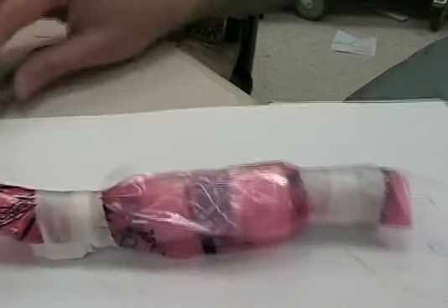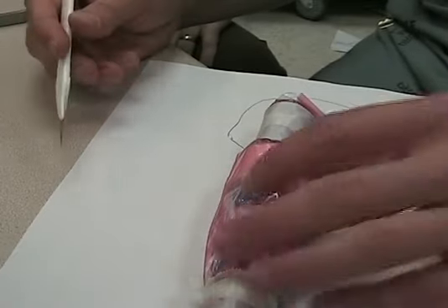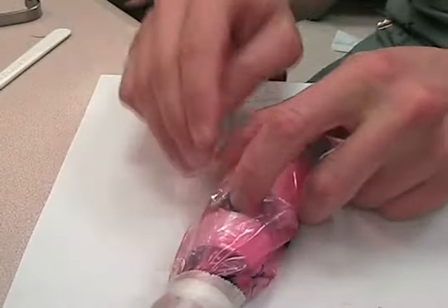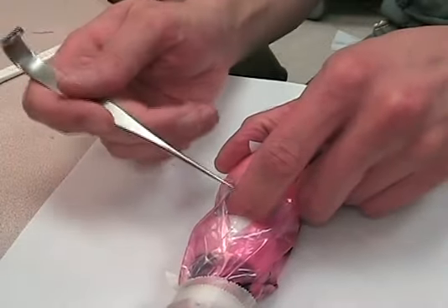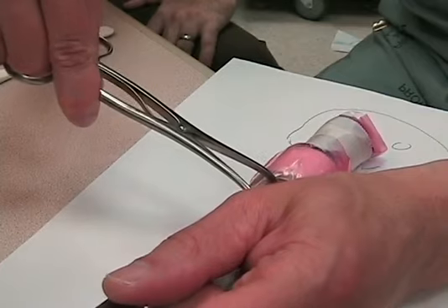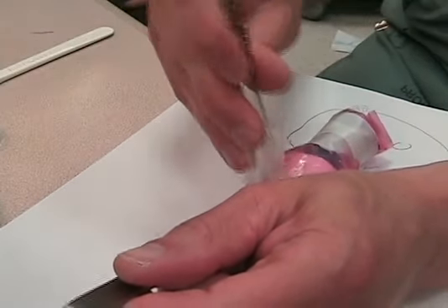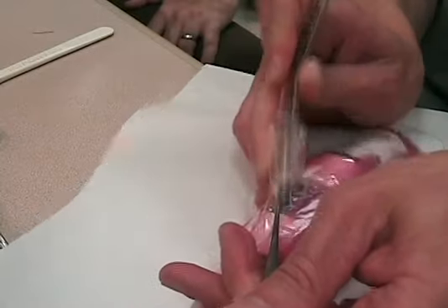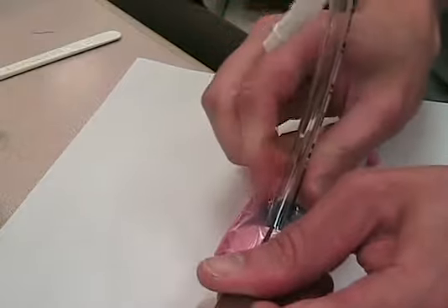Let's say you're alone — you don't have a partner. In this case, you're actually going to stand close to the head of the patient's bed. The same initial steps: find the membrane with your finger, stabilize, cut from the bottom of the cricoid up to the bottom of the thyroid, feel your membrane, incise the membrane horizontally, and get your finger in there. Now you're going to use the hook, but orient it towards the feet — use it almost like a laryngoscope to open up the membrane. Get your trousseau in, dilate from head to feet, take your dilator out, then using the hook to hold out the bottom of the membrane and the top of the cricoid, insert your tube as if you're intubating. Go in horizontally, orient vertically, and push your tube in. That's how you do it with one person.